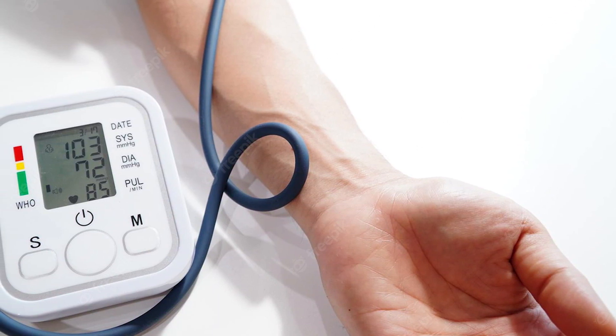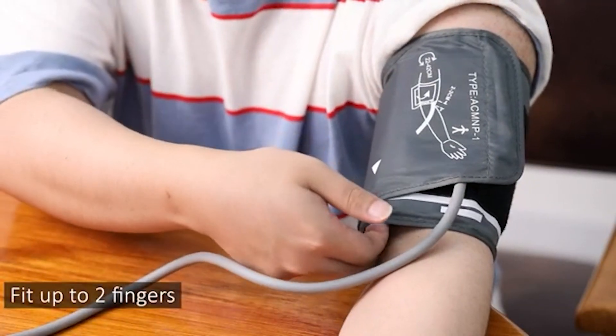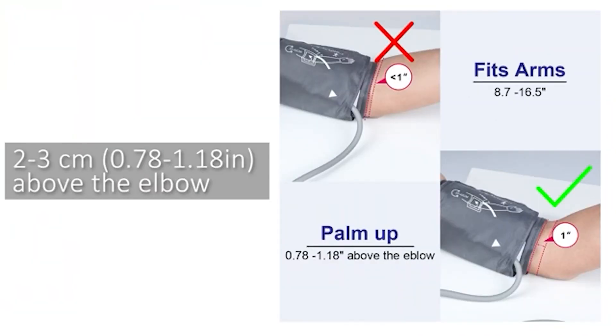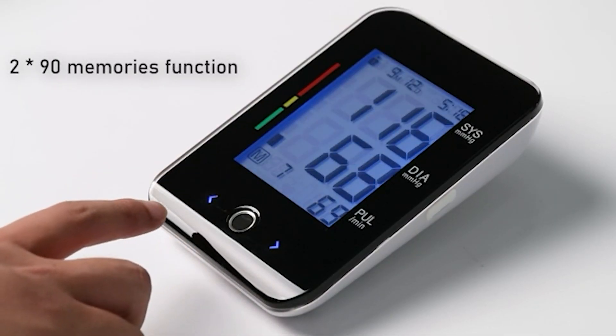While patients do not need a prescription to buy a blood pressure monitor, encourage them to bring it into the office on their next visit so you can test the model they choose against your clinical quality manometer. This will give you and the patient a good idea of how accurate the at-home model readings are.